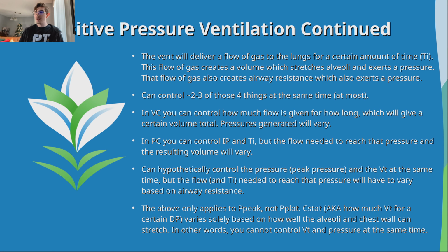Your static compliance, meaning how much tidal volume you get for a certain driving pressure, varies solely based on how well the alveoli and chest wall can stretch. In other words, you cannot control tidal volume and driving pressure at the same time. Those two things, there is nothing that you can do. There's no way that the ventilator by itself can magically improve static compliance, right? There's nothing you can do to do that. We'll talk a little more about that later.